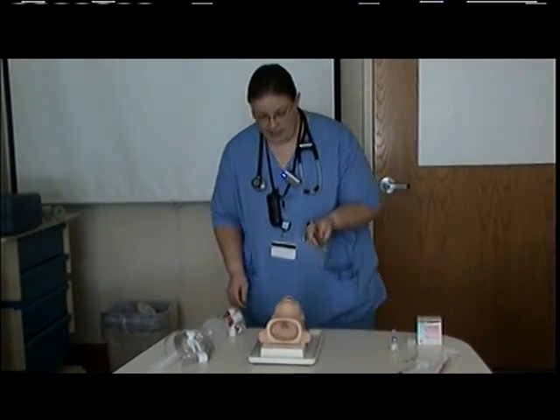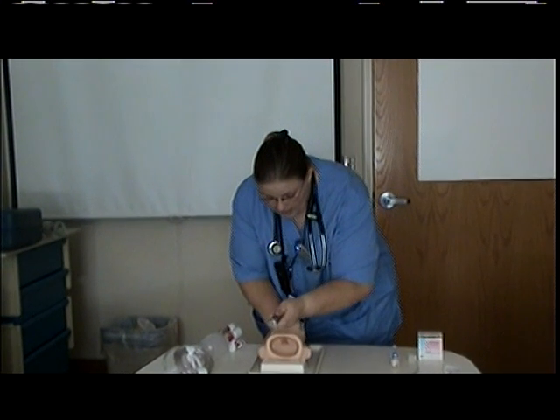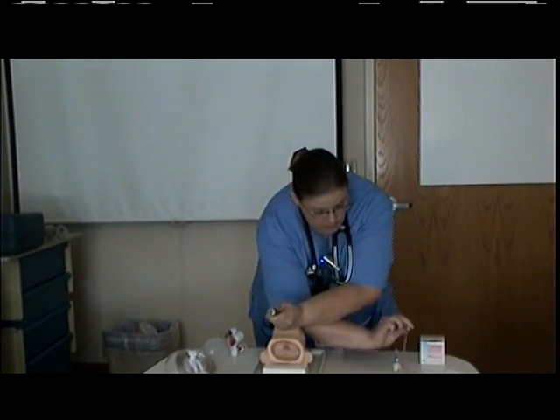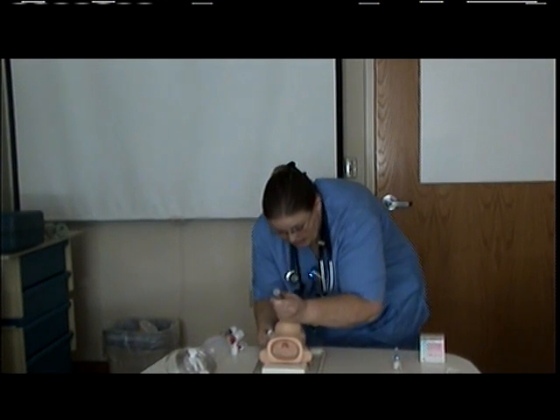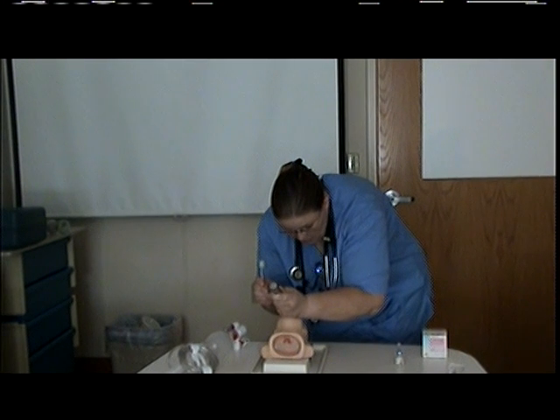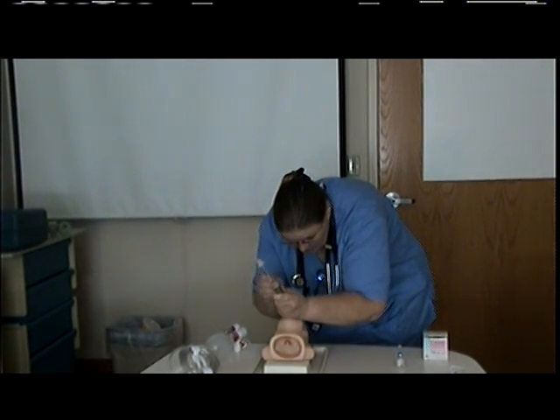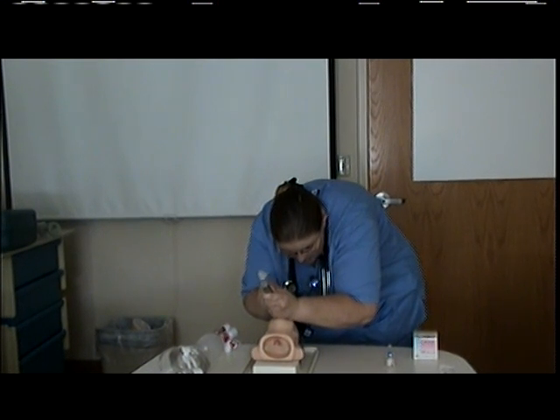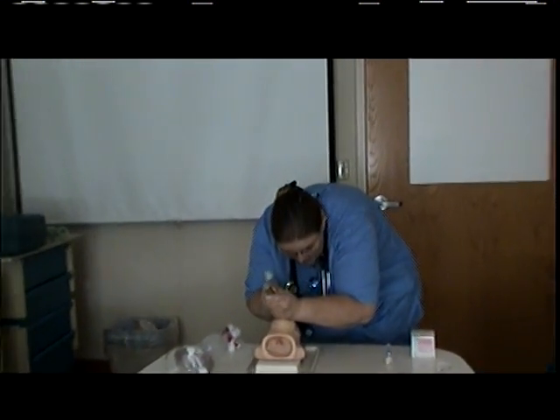We are then going to intubate the infant. Knowing that he weighs two kilograms, we are going to insert the tube, which is a size three ET tube, because he's between one and two kilos, and we are going to insert this. After you visualize the glottis, you're going to insert it to a depth of eight centimeters.